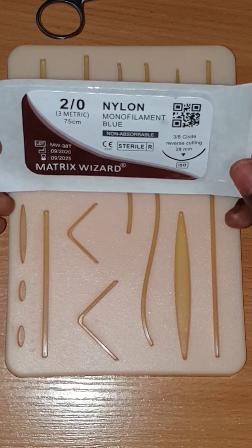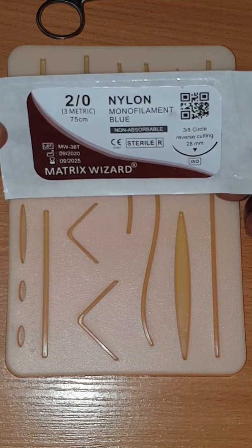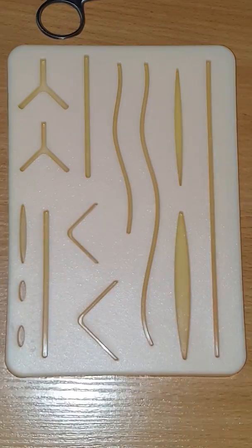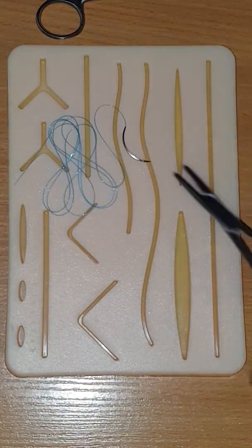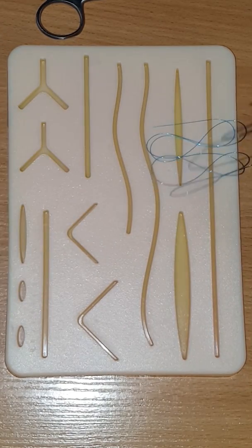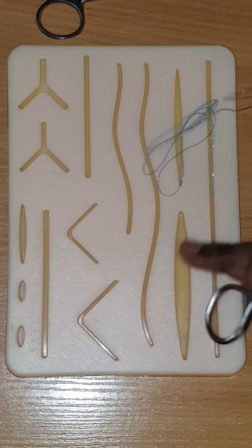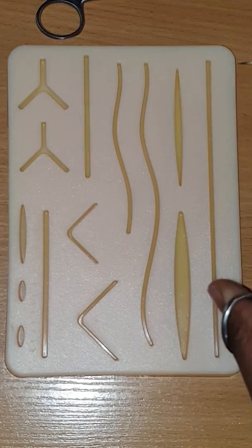Today we're going to be using this 2-0 nylon monofilament suture — it's blue. We're going to go ahead and choose this incision right here. Now this is a hemostatic suture, so I would choose this incision, but I've tried to practice on it and I need a new suturing pad — it's very damaged. So we're going to go ahead and do this one instead. Let's begin.